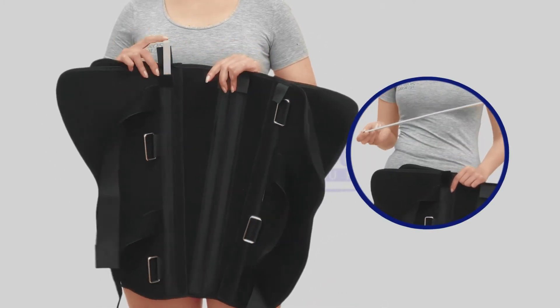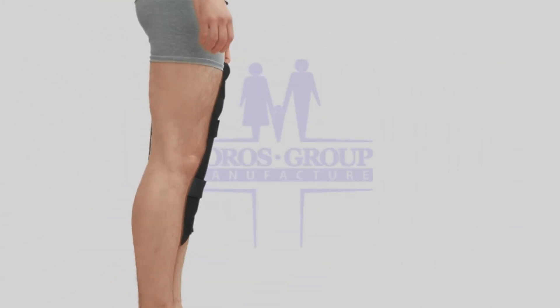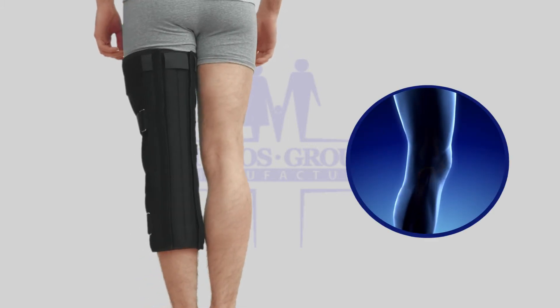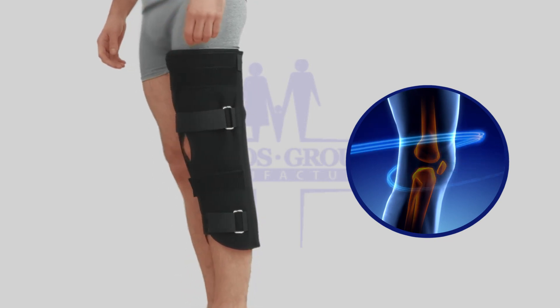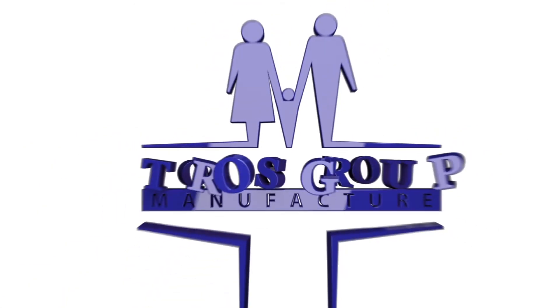Following injury or trauma, it can be used during post-operative recovery to help rehabilitation and to assist controlled walking. Immobilizing the knee helps muscles, ligaments, and tendons to rest, recover, and heal.